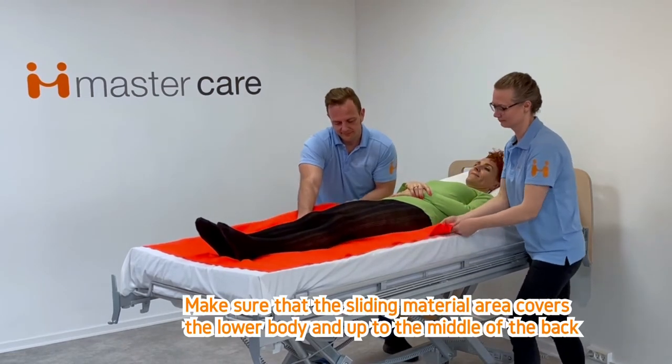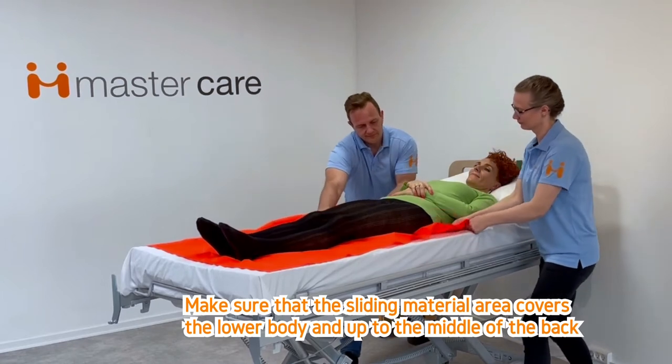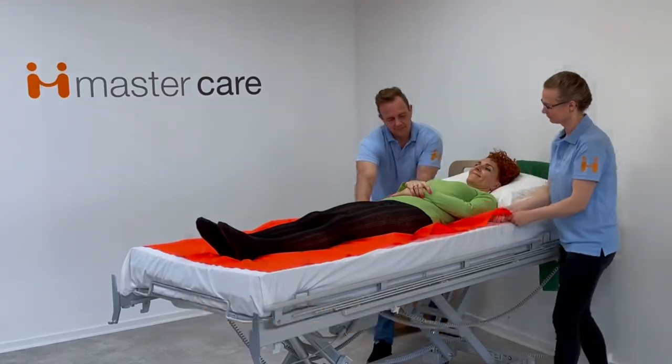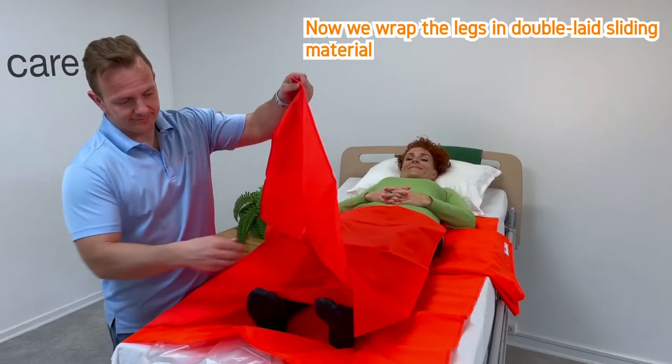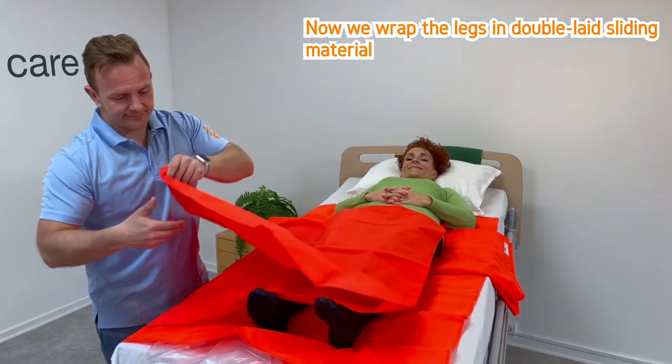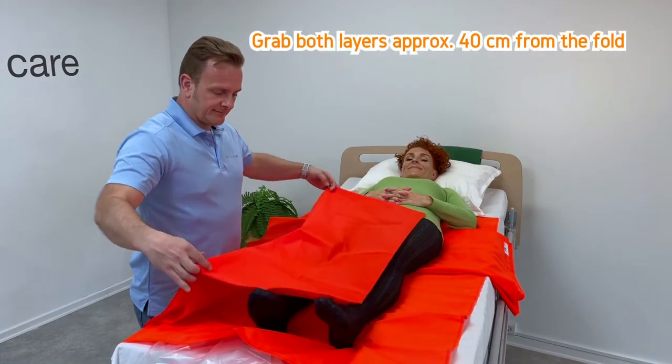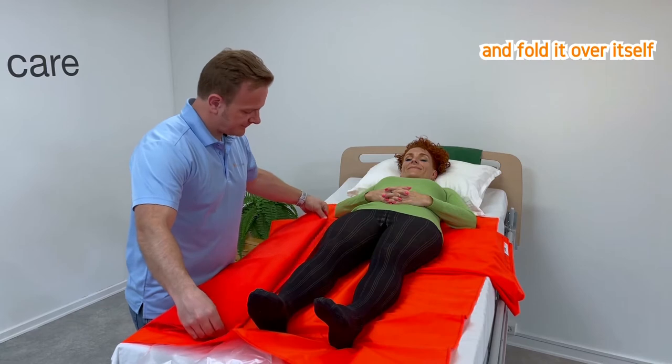Make sure that the sliding material area covers the lower body and up to the middle of the back. Now wrap the legs in double-layered sliding material. Grab both layers approximately 40 cm from the fold and fold it over itself.